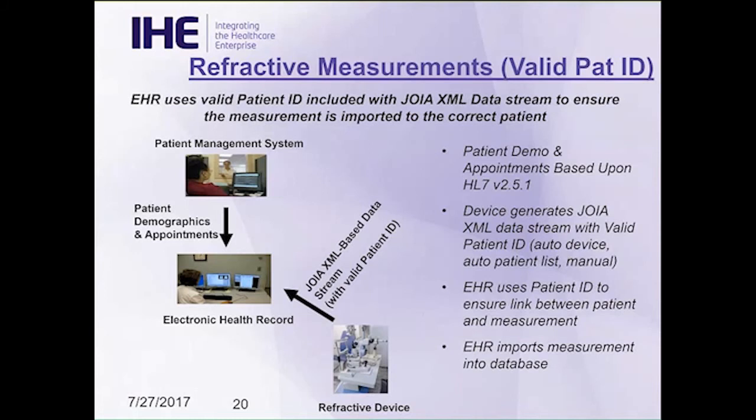However, there are some refractive devices that have some capabilities to actually generate or create a valid patient ID. I guess they're not really creating it, of course. That comes from the practice management system. But they might have barcode capability or something that they can input it into their system.